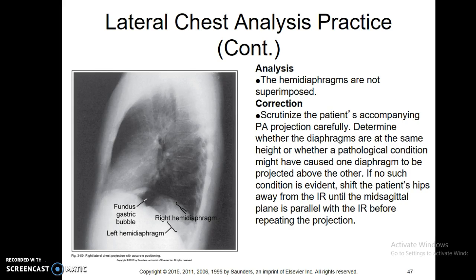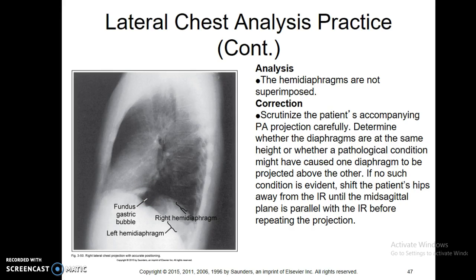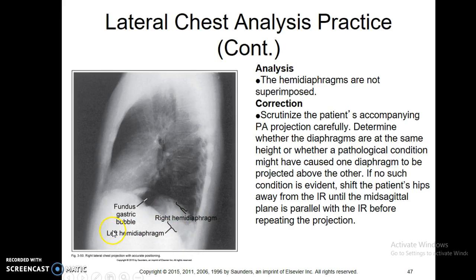This slide is wrong — it does not make sense. This right here is the fundus; the gastric bubble is right here, and we know that fundus is on the left side unless the patient has situs inversus. That would make this the left hemi-diaphragm, because it's sitting right underneath this diaphragm. What we've told you before — the one that's going to extend downward and be more inferior is typically going to be the right, not the left hemi-diaphragm. The right lung is going to look bigger because of magnification if this was actually done as a left lateral like it should have been.